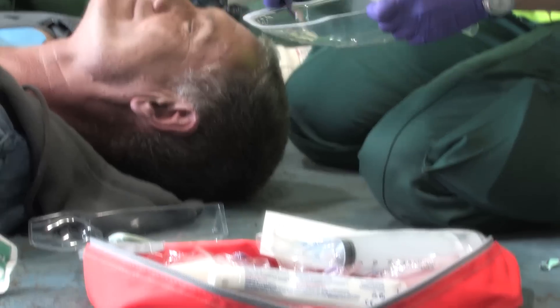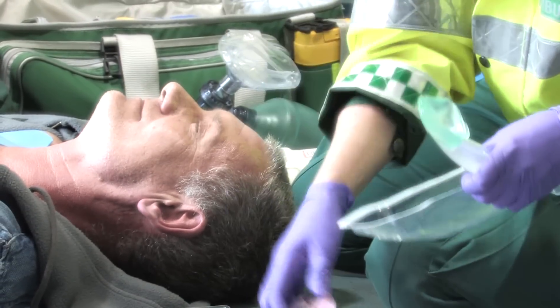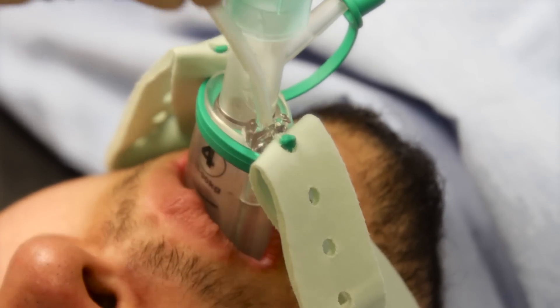It's really everything you need to prepare, insert and secure the IGEL-02. So it includes the IGEL-02 itself, it also has a sachet of lubricant for lubricating the device before insertion, an airway support strap for securing the IGEL-02 in place, and finally it has a suction tube for inserting down the gastric channel to empty the stomach contents.